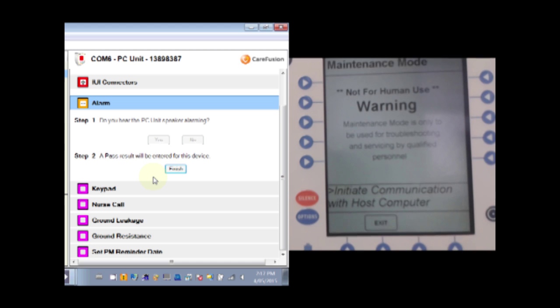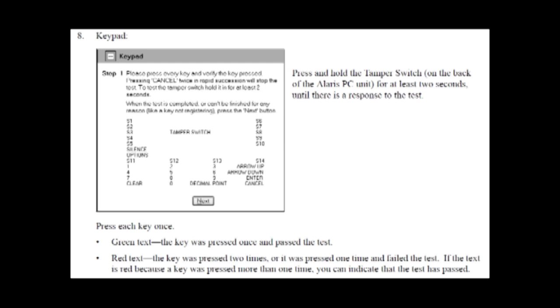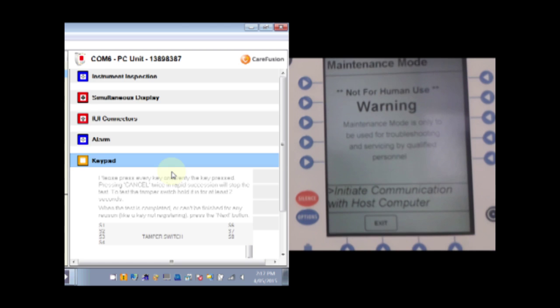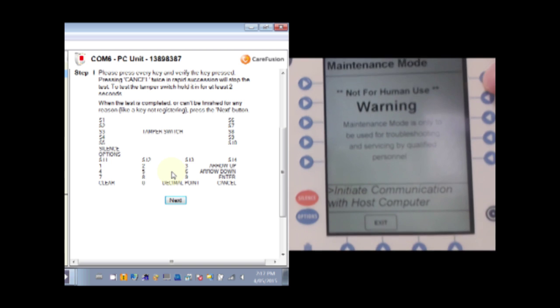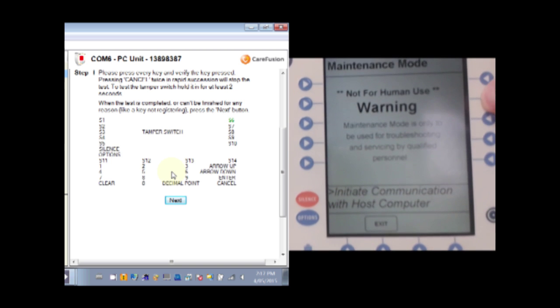Audible alarm. The keypad test is pretty straightforward. You just press each of the keys and the corresponding label goes green. If you double press a key it will turn red.